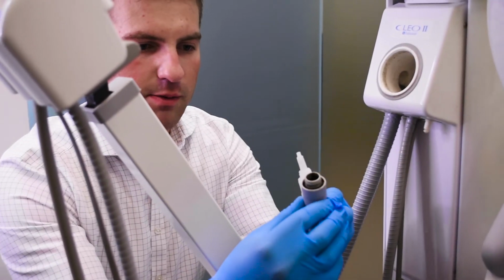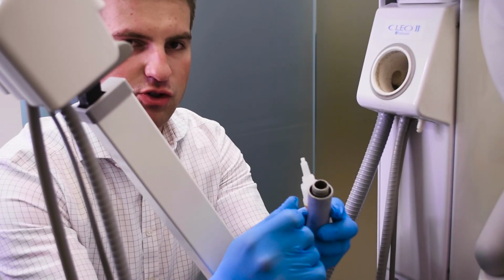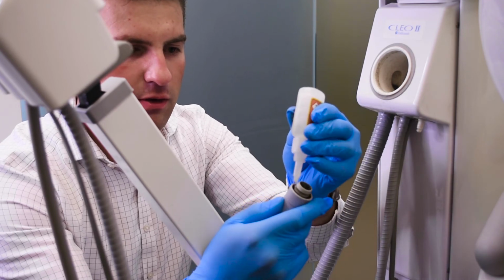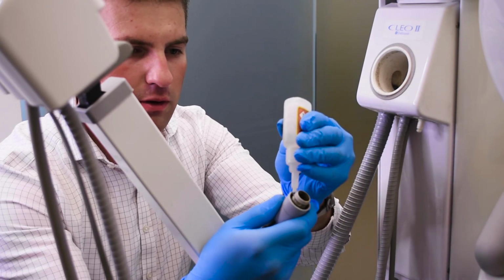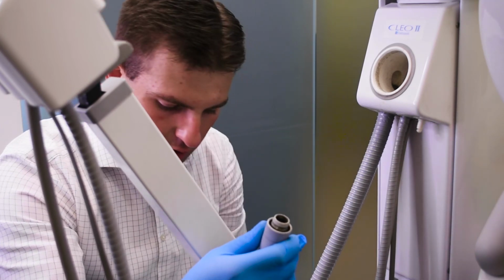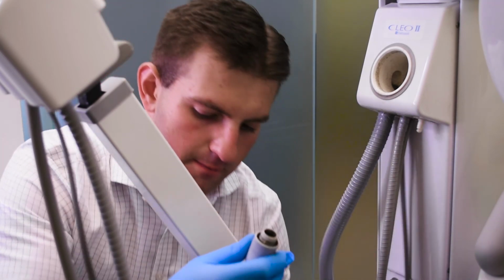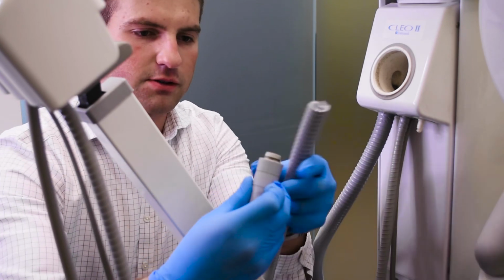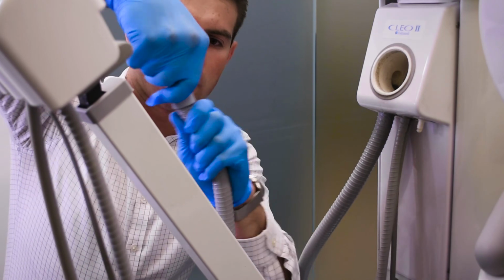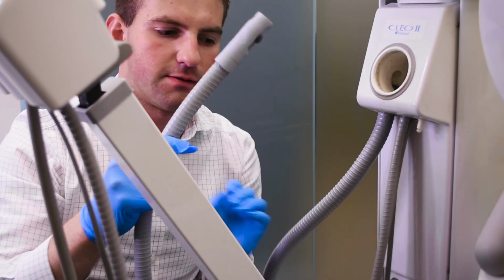So the suction tip valve, make sure this surface here is dry and clean, and apply a couple of small dabs to the barb. Take the other end of the suction hose and just push and screw, and then leave for the glue to dry.